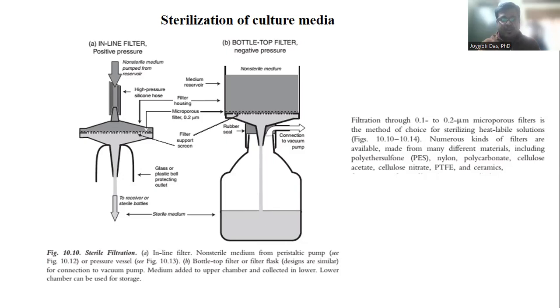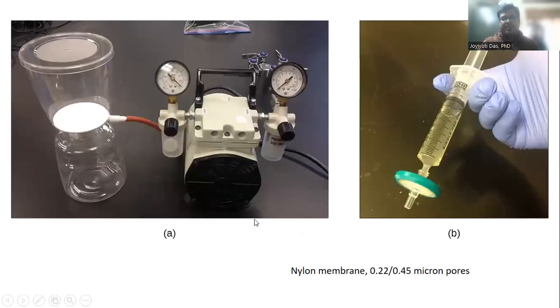of 121 degrees Celsius. So what needs to be done instead is membrane filtration, wherein you use a filter and pass your medium through that filter. That filter will have a pore size of, say, 0.2 microns, which prevents the passage of any contaminating microorganisms through it. And so what you receive down in this reservoir is your filtered media.